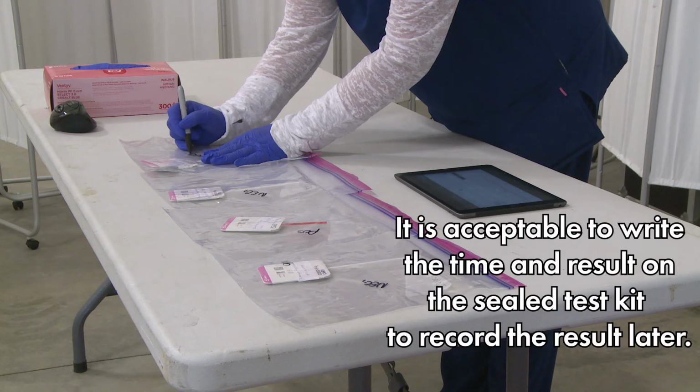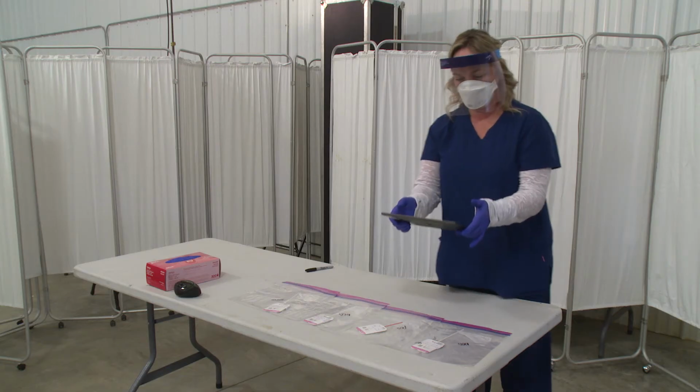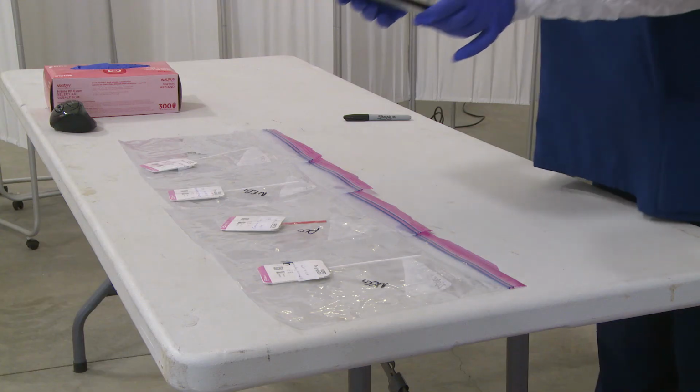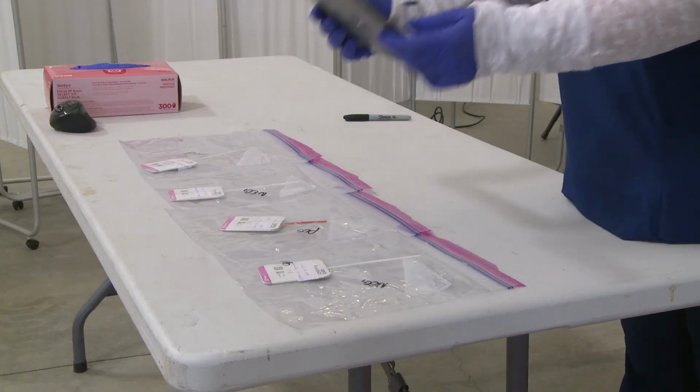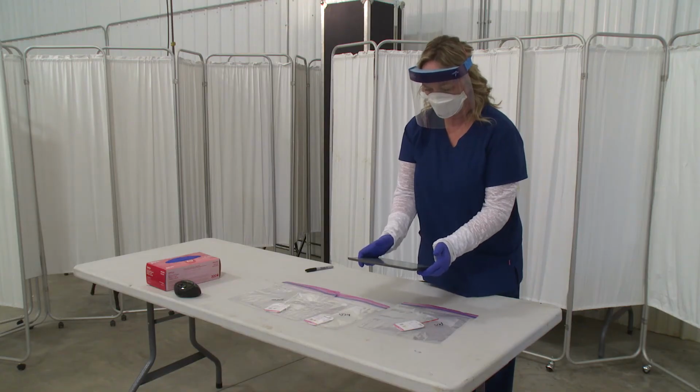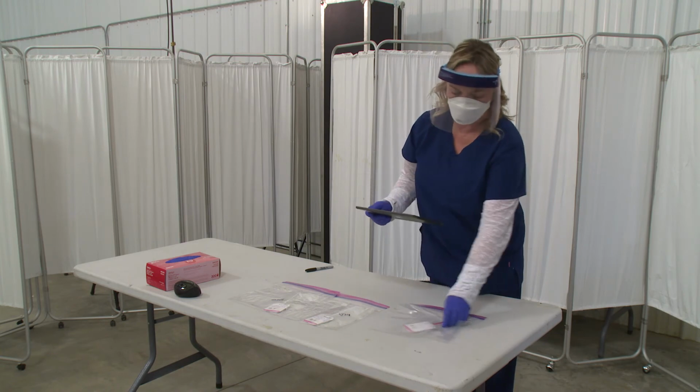If it is a busy location and you're unable to record results of those test kits within Dynamics within that time frame, it is very acceptable to note on the outside of the bag the results of that specific test within the 15-minute time frame of reading. When you are able, and as soon as possible, because this is how individuals will get their test results, it is important to record those results within Dynamics. And again, there's an instructional video of how to record results in Dynamics.